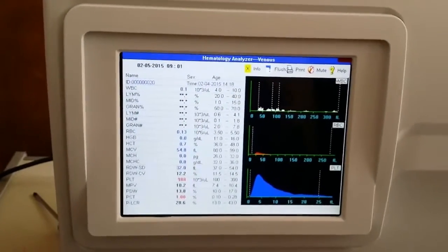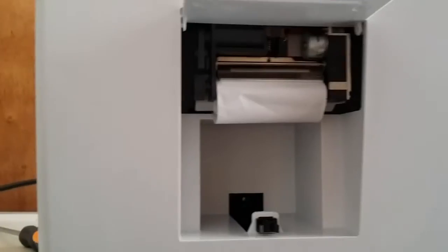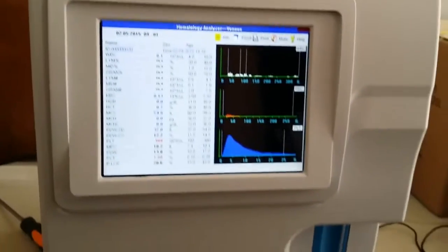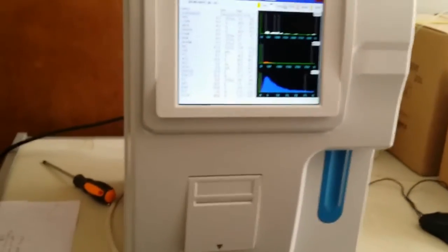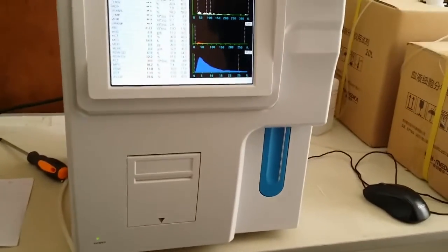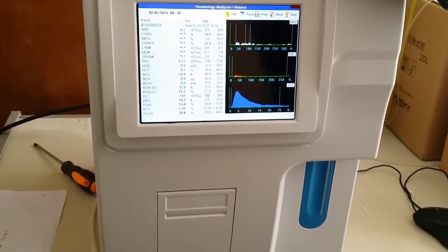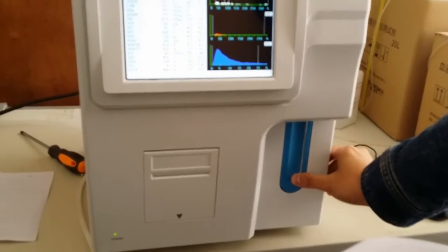Turn to fix the print paper. After everything is okay, then before doing the sample test, first you should do the background check. Press the sample test button.